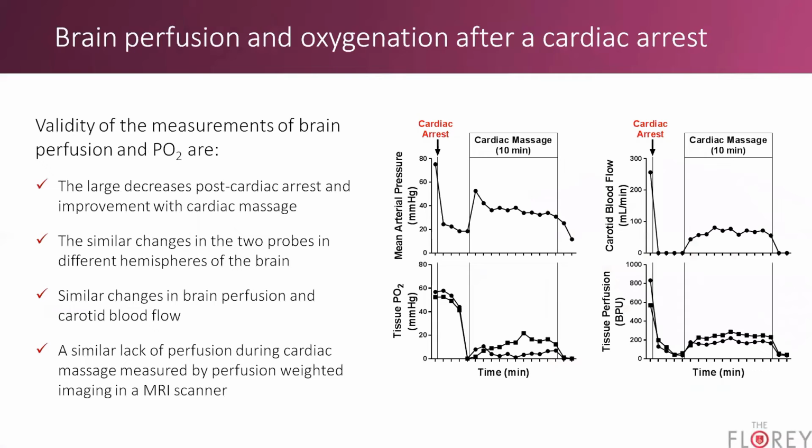So the experiment we did was to look at the effect of cardiac arrest followed by open chest cardiac massage. And we were looking at the effects on mean arterial pressure, carotid blood flow, and tissue perfusion and oxygenation measured by the probes in the left and right hemispheres.